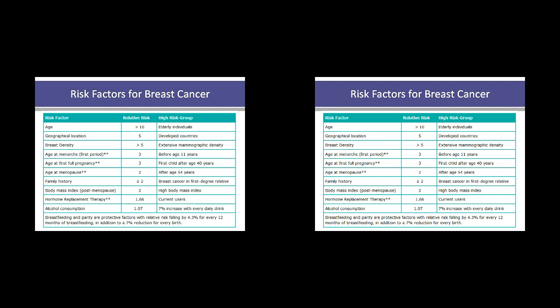Mammograms are not very good at diagnosing cancer in dense breasts because the tissue just appears as a big cloud of white. So if high breast density has been diagnosed, then women are often suggested that they go for MRI or ultrasound as a follow-up.